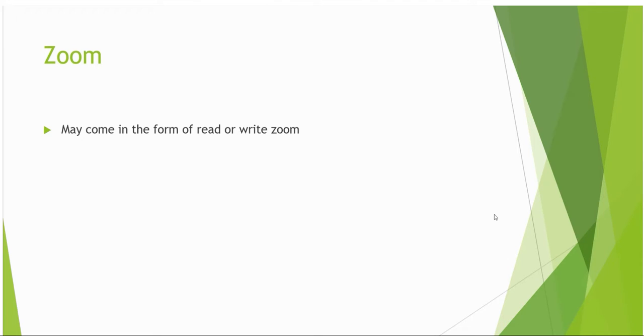Zoom is a function we're all familiar with, and as we know, comes in one of 2 forms. Read zoom is simply a magnification process of the information that's in the system memory obtained from the field of view. It does not alter spatial resolution, and despite the box creating an effective smaller field of view, the frame rate does not adjust.